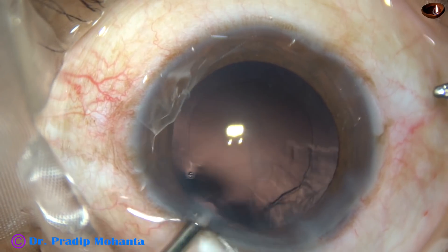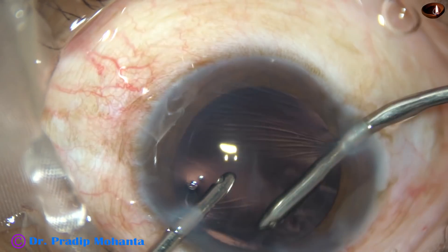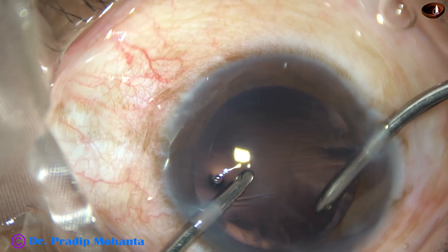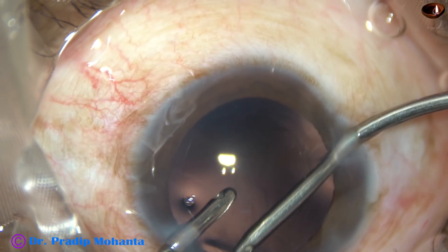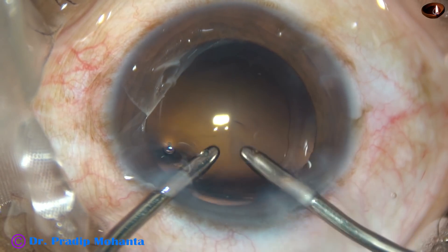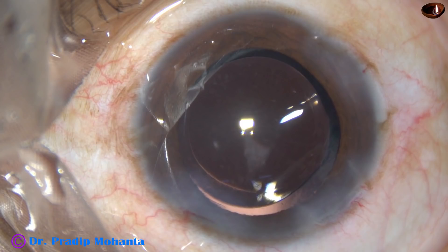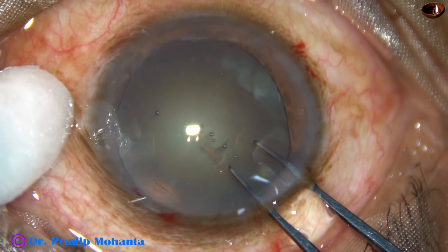After cortical cleanup with bimanual irrigation aspiration and by polishing the posterior capsule, a foldable intraocular lens is implanted in the capsular bag.